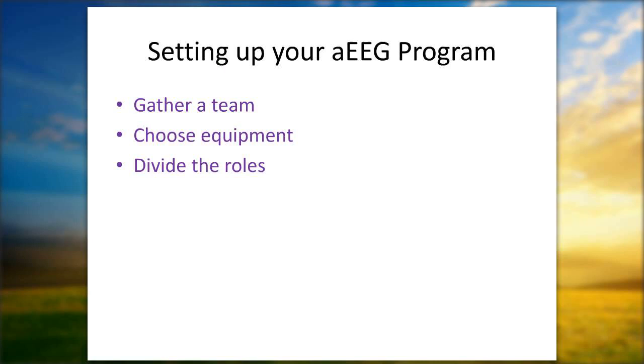This needs to be a multidisciplinary team. So physicians, nurses, neurologists, neonatologists. You might want to get some people from IT involved, as well as, of course, bedside nurses, advanced practice nurses, just a really well-rounded team, because you're going to need to come at education and support from a lot of different angles. So getting that team, getting some people who are excited and invested is really going to be critical to getting your program up and running.